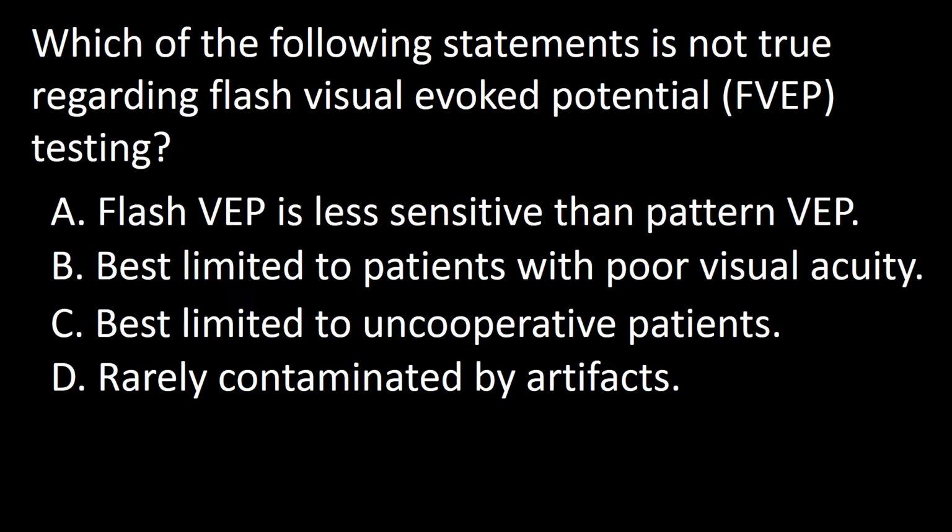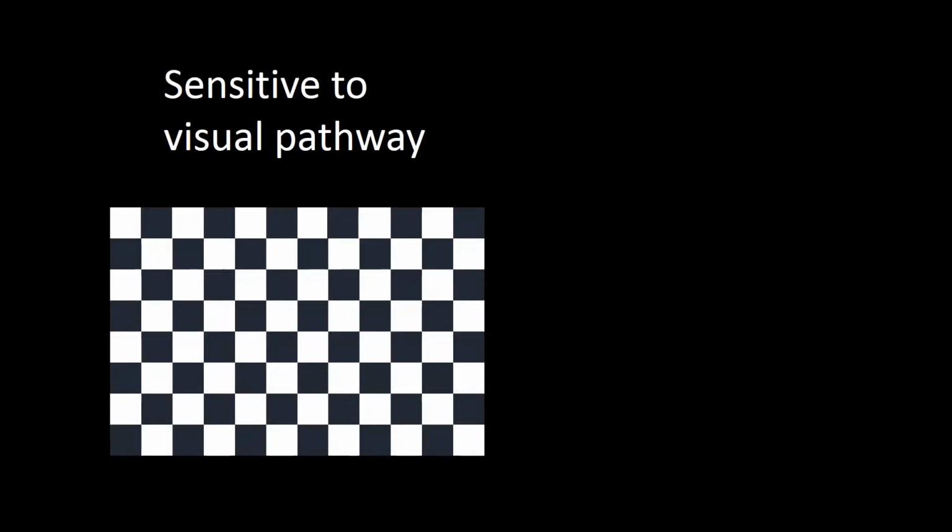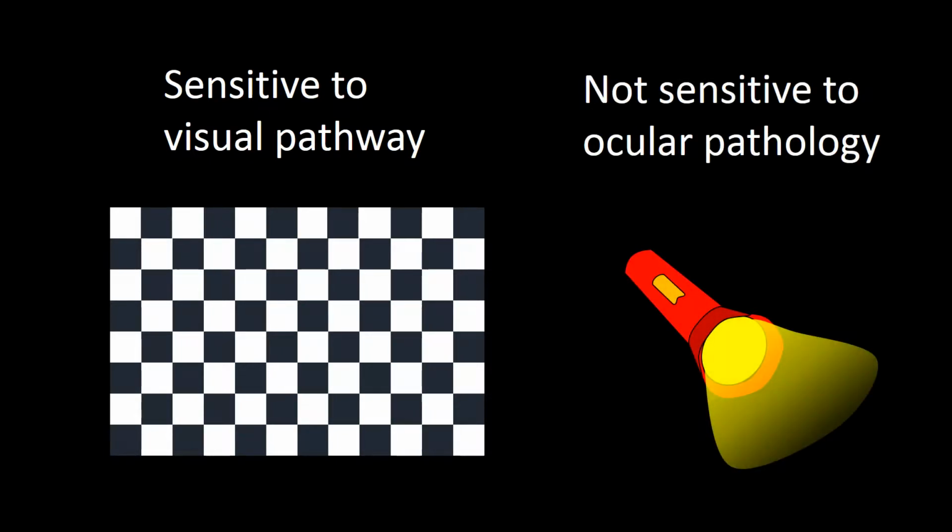C. Best limited to uncooperative patients. D. Rarely contaminated by artifacts. Pattern VEPs are sensitive to ocular pathology. Flash VEPs are not sensitive to ocular pathology.